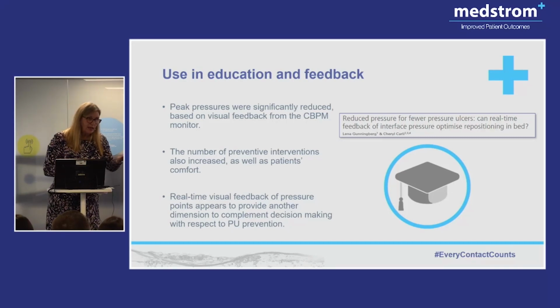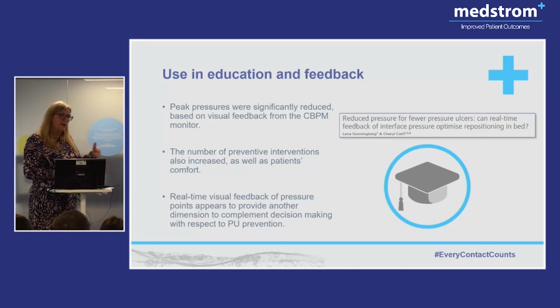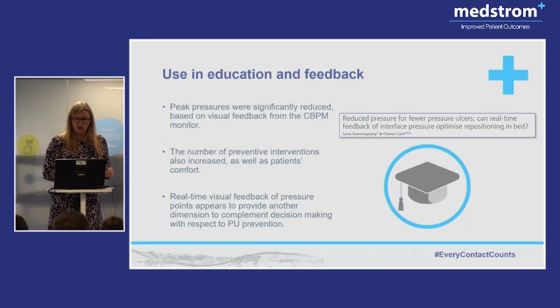So staff were seeing the reading on the monitor, they were seeing the amount of red and thinking, oh, I need to turn this patient, or I need to reposition this patient, I need to move a leg, I need to put a device in situ. And that real-time visual feedback for staff meant something to them. It wasn't this abstract tick chart that says turn every 2 hours, tick it, right, back, left. It was, look at this patient's skin on a monitor and see where the high points are, do something about it.